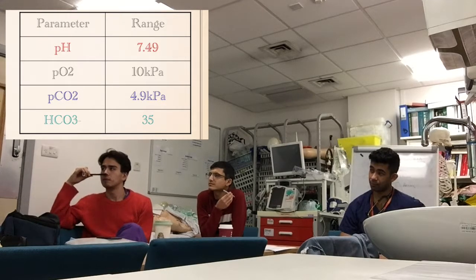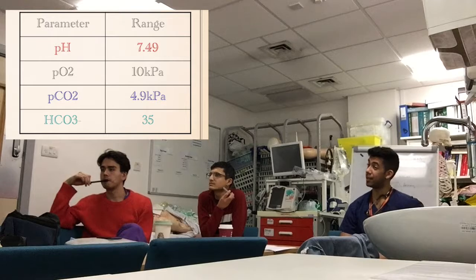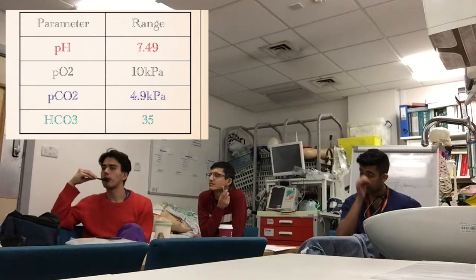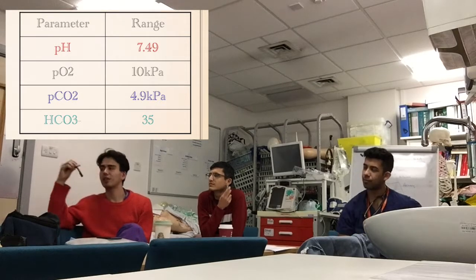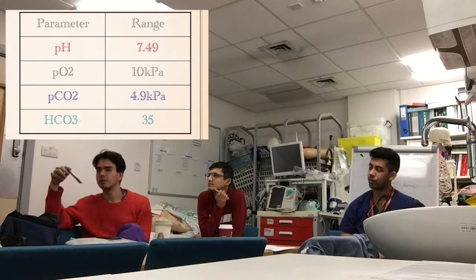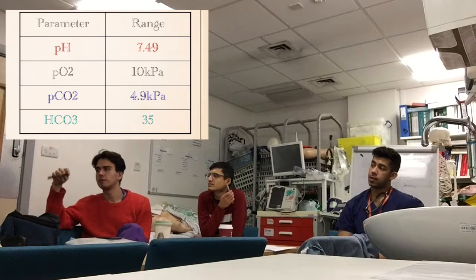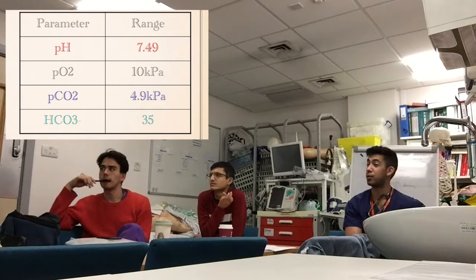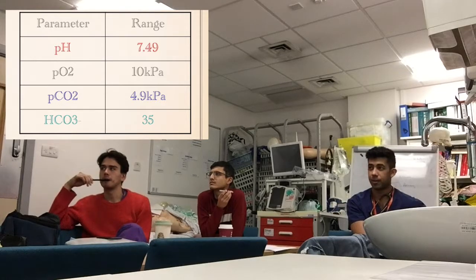The oxygen and the carbon dioxide are normal, just about. The patient isn't hypoxic, but the bicarb is really raised at 35. So is it a metabolic alkalosis? Yes.